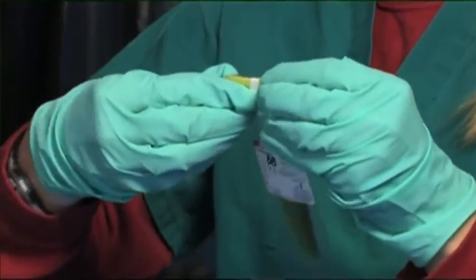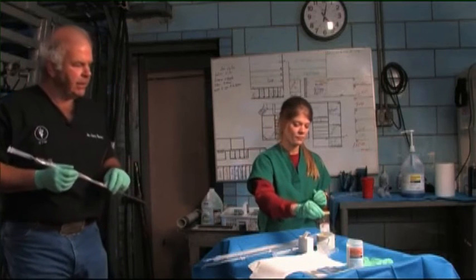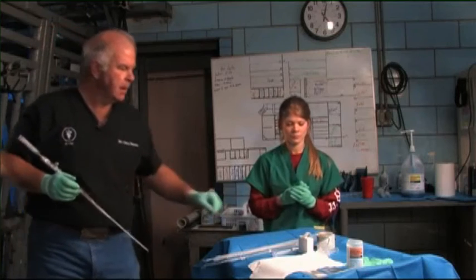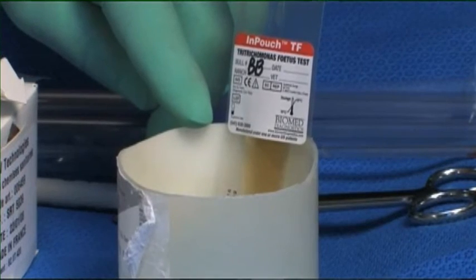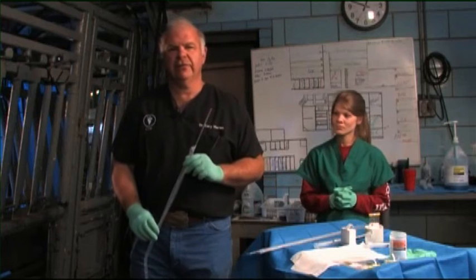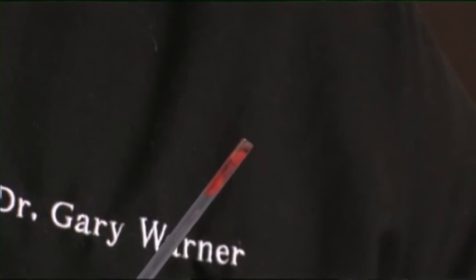We'll seal the pouch by turning the little yellow tabs and place it in our container in an upright position. We want to make sure to protect these samples from direct sunlight and keep them at a temperature between 68 and 100 degrees Fahrenheit. Over-aggressive sampling can lead to bleeding, and that's unacceptable. And now that we've completed our testing, we'll transport our samples back to the clinic for shipment.